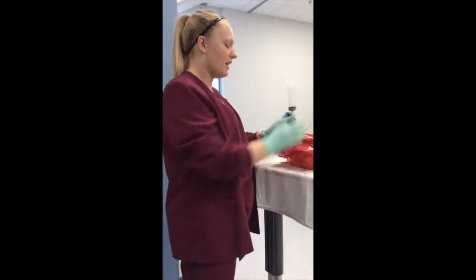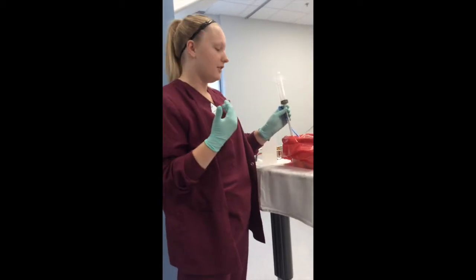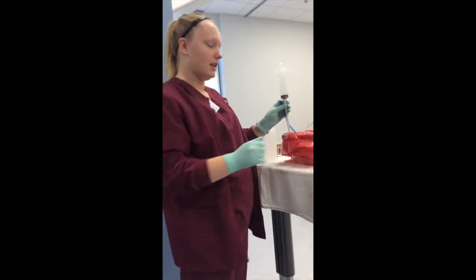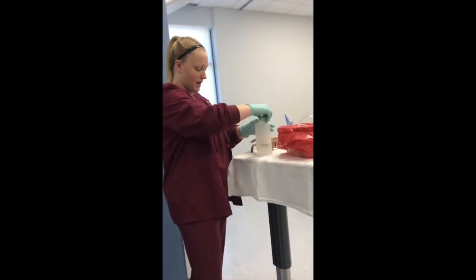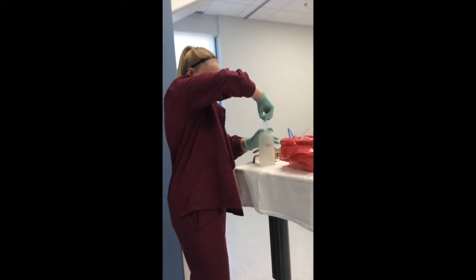And something that I will want to have made sure is that this tube is placed correctly. If they're on a feeding, it should be placed correctly, but that's something that I would definitely check before I do anything with it. Okay, so I've already checked gastric residual volume. I'm going to go ahead and flush with 30 milliliters of my water.